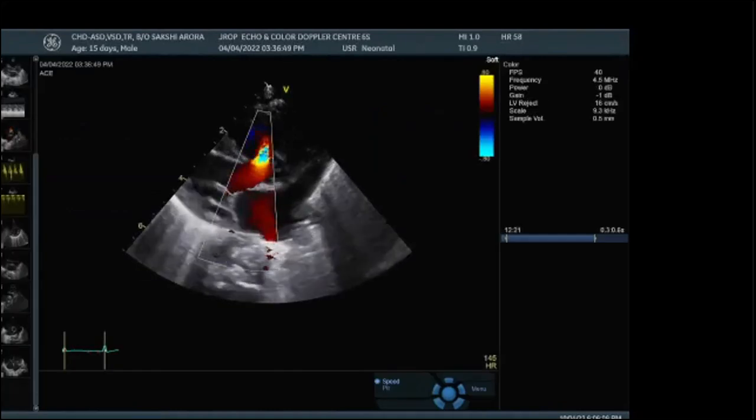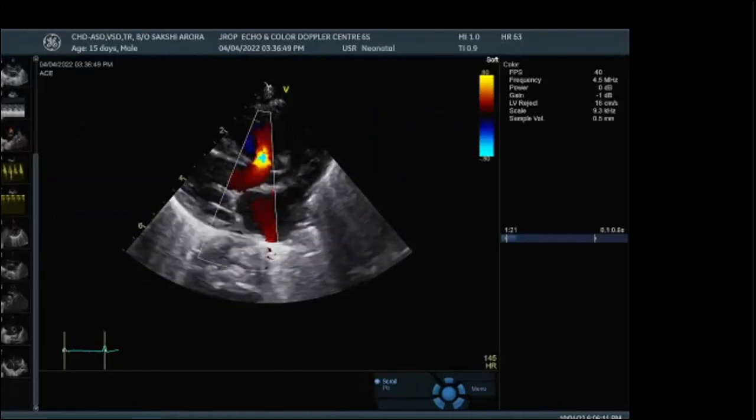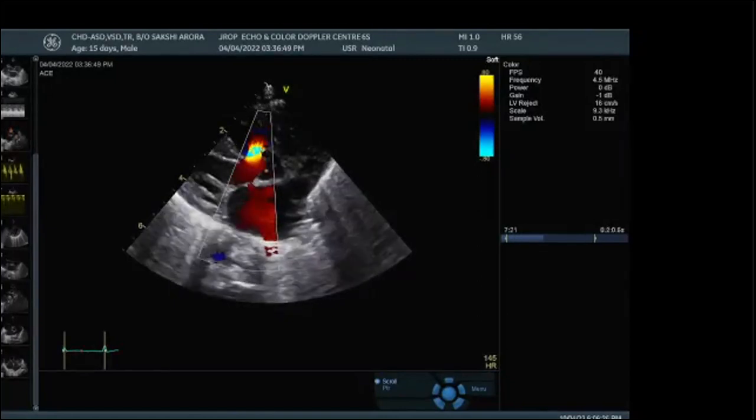I'm back to the same slide again, right? Yes, sir. Now look, two important parts. This is a QRS cycle over here. Can you see the QRS cycle? Yes. Can you see this red button? Red cursor? Yes. Now I'm going to scroll this cursor to the end of systole.